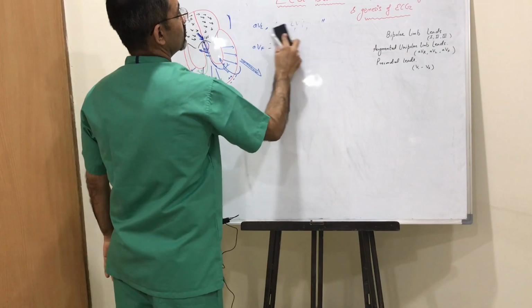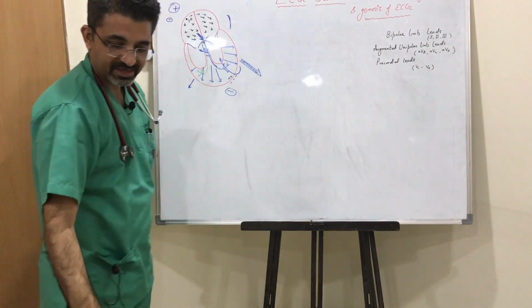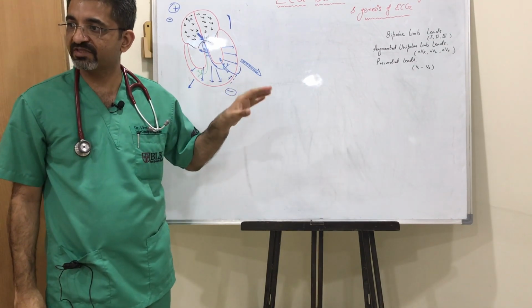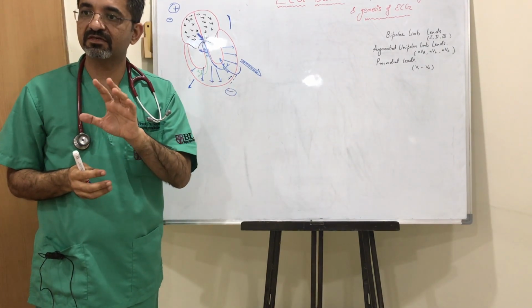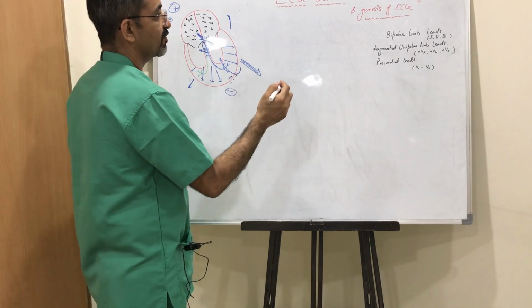Now we will come to precordial leads. I hope generation of PQRST is absolutely clear, what they mean, right? QRS doesn't mean contraction. QRS just means depolarization. So now we come to precordial leads.